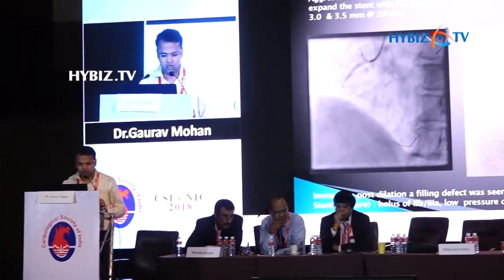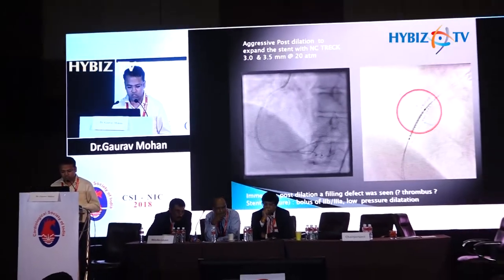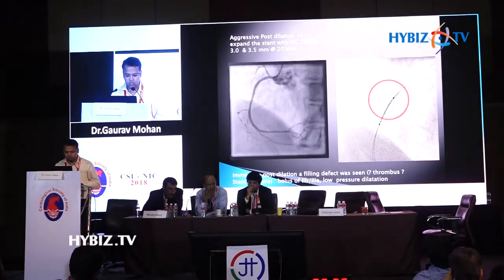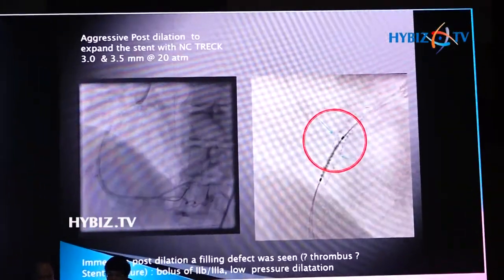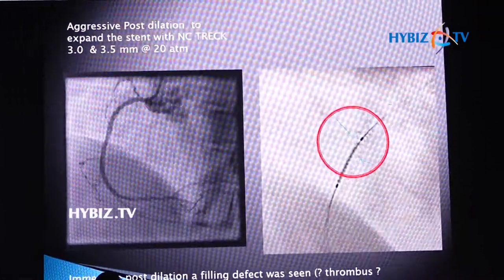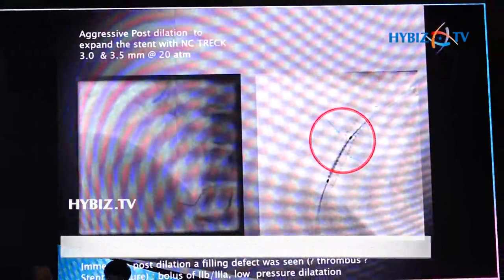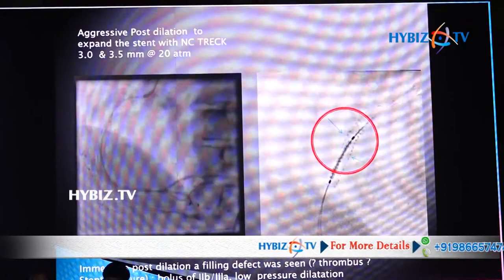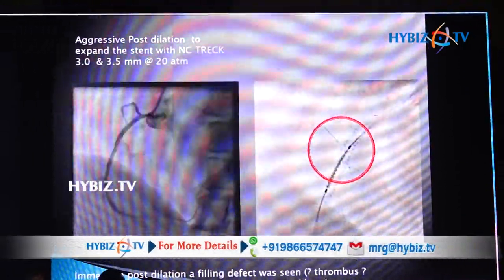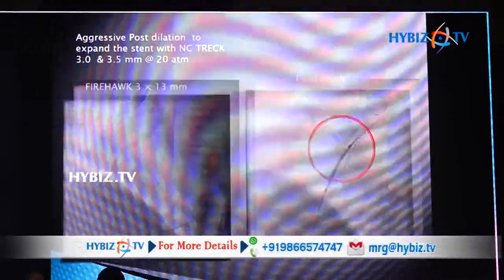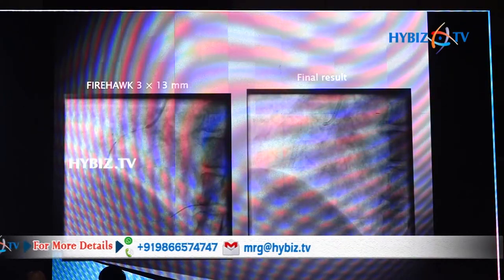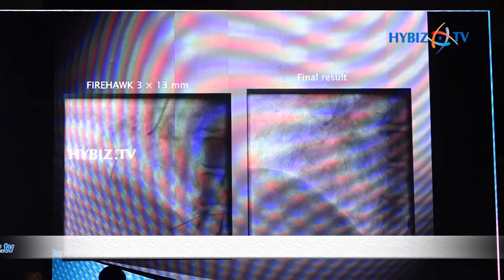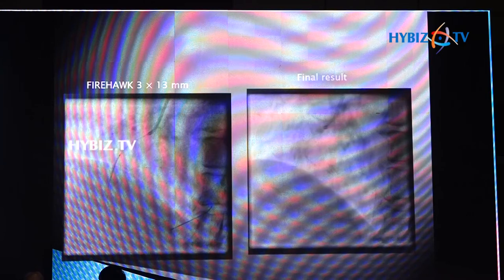The haziness — we thought some thrombus formation had started. Although we had dilated to such an extent, we gave 2B3A inhibitors and some low-pressure dilatation but nothing was visible. On the stent boost image we could find multiple stent fractures. Possibly the post-dilatation had disrupted the stent architecture and a medial tear produced a thrombus. So we overlapped another Firehawk 3.0x13 into the vessel.